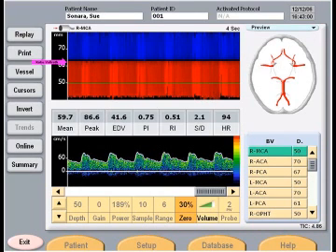So that's why I love the M mode. I use it every time I do an exam or teach TCD technique nowadays.